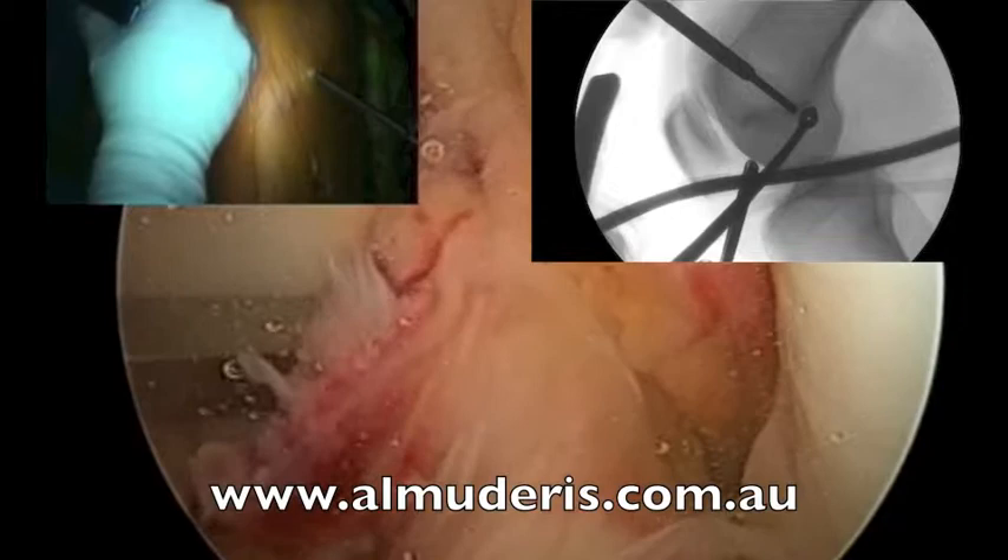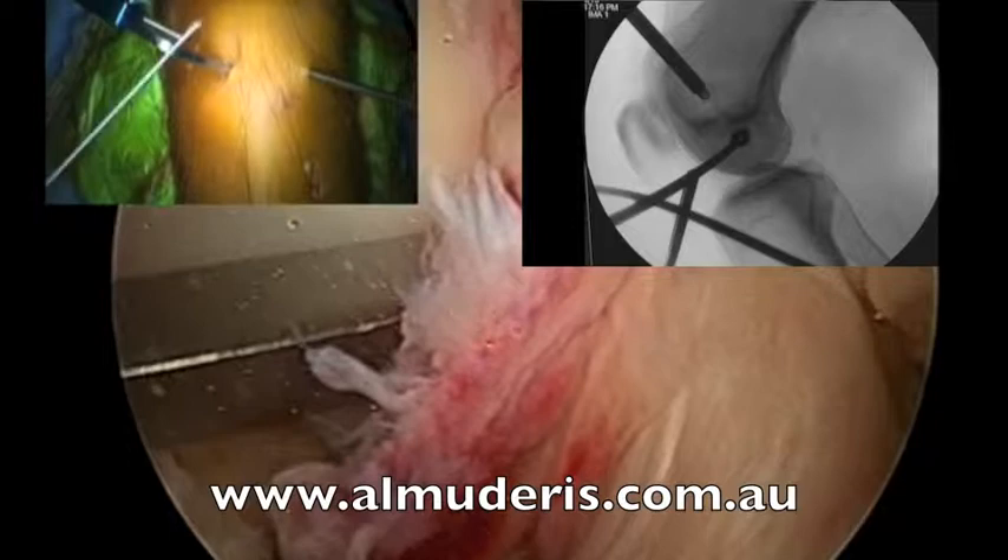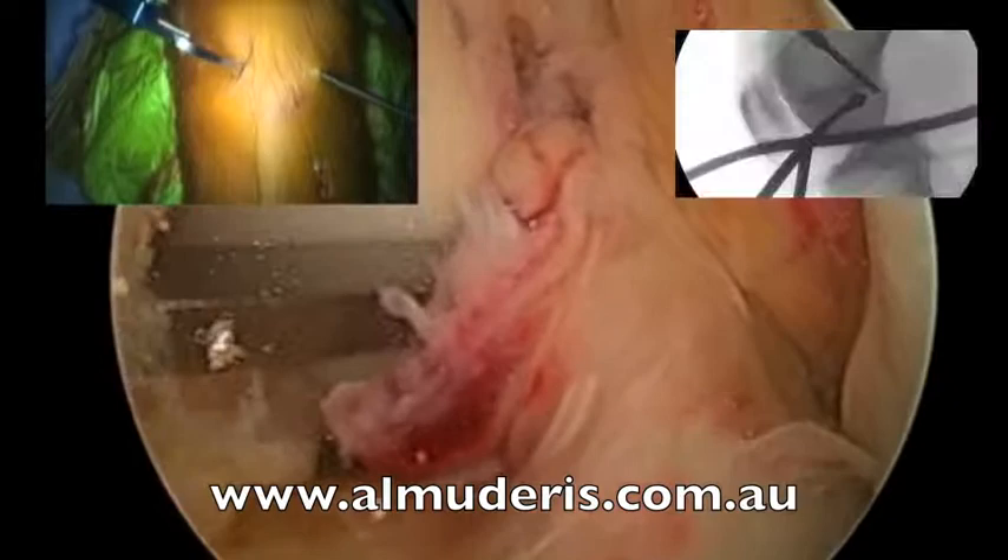I now drill the flip cutter inward. X-ray — save this one. I am through the condyle, then I pull the flip cutter out. I make sure that it flips, and I clear the debris.